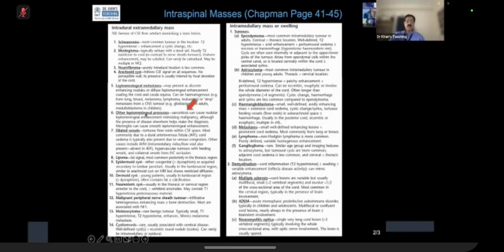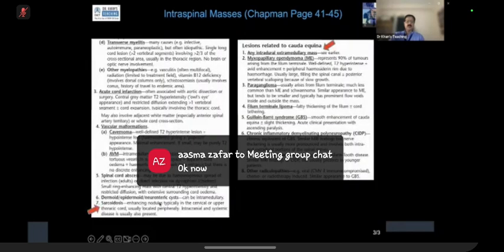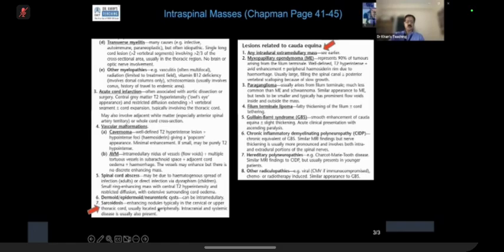The basic concept is that with sarcoidosis, the most involvement is of the leptomeninges. And please remember, from the leptomeninges, it will go into the parenchyma, and of course, vice versa, as in the dura can also be involved. In intradural lesions, you see enhancing nodules, typically in the cervical and upper thoracic cord, usually located peripherally. What do you mean peripherally? Because they come from outside inwards, from the pia mater or the leptomeninges. But imaging wise, for you, it will be an intramedullary lesion.